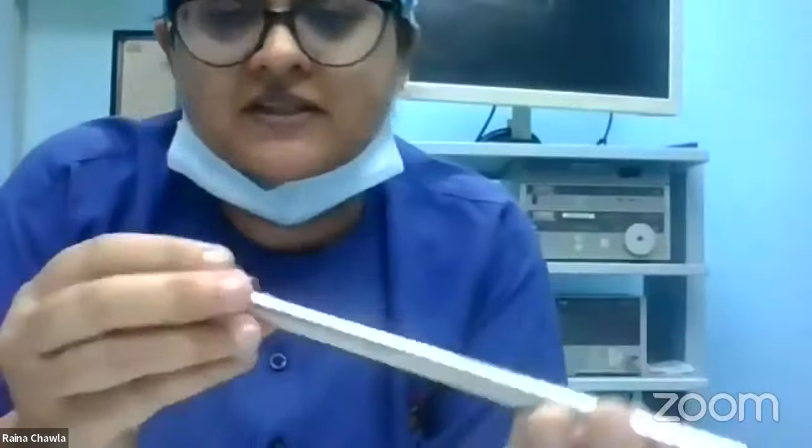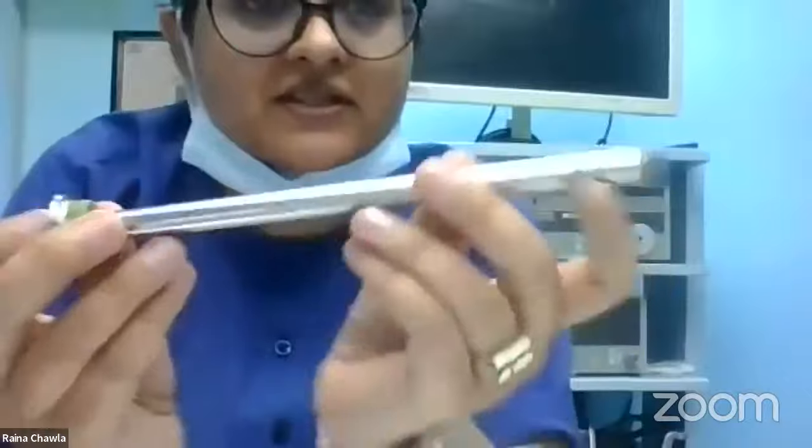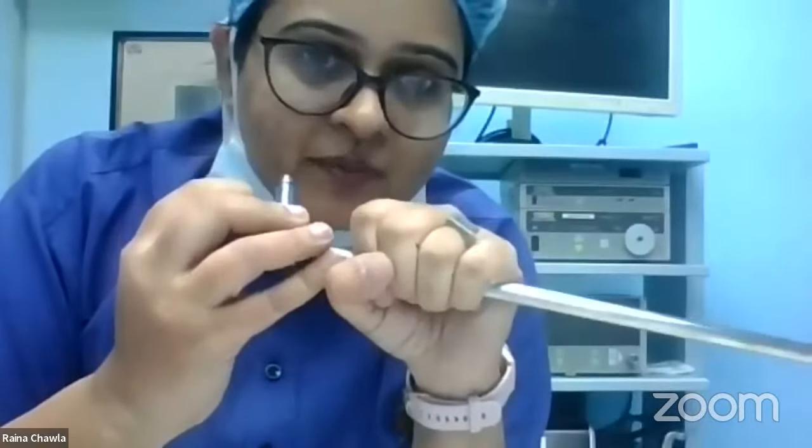See this. Okay, this is actually just the trocar. She's not given me the cannula. Okay, so you can see this is a very sharp instrument. It comes with a sheath. She's not given me the sheath. This is just the trocar. It comes with a cannula. Okay, so once the Veress needle creates the pneumoperitoneum, we then introduce this in the cavity, remove the trocar, and the sheath remains. Through the sheath, the laparoscope goes inside. So this is my primary port.